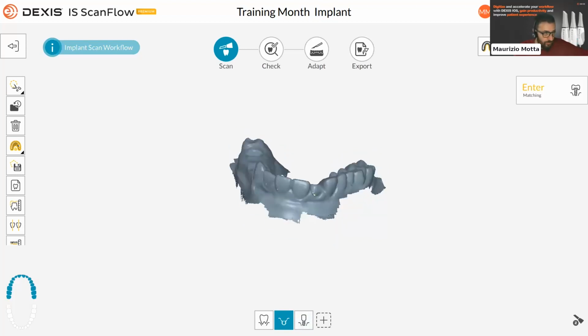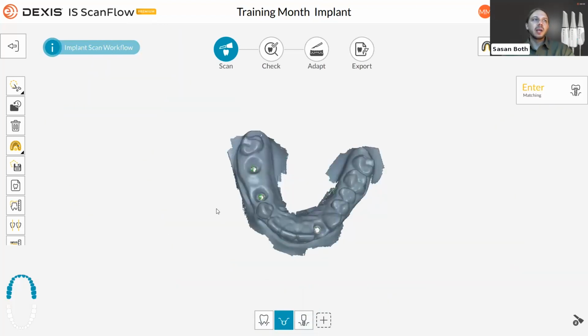Okay, last question, then we go to the scan body AI. What's the common mistake during the implant scanning? I think if you just keep the general scan tips in mind of how you're supposed to scan, then there's very little you can technically do wrong.